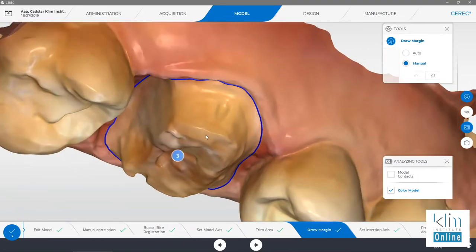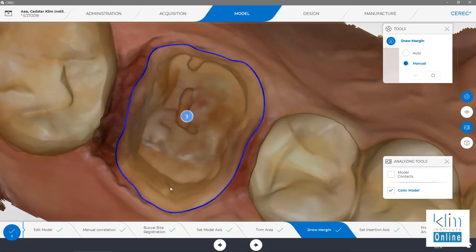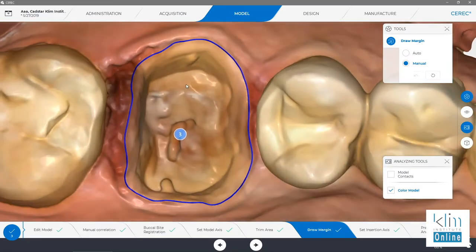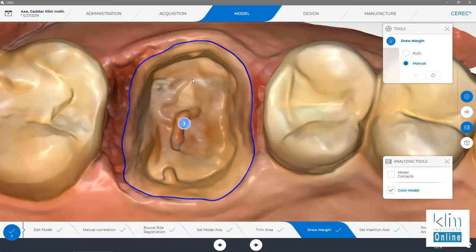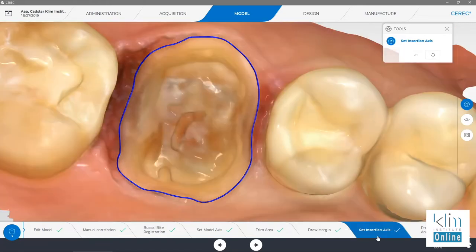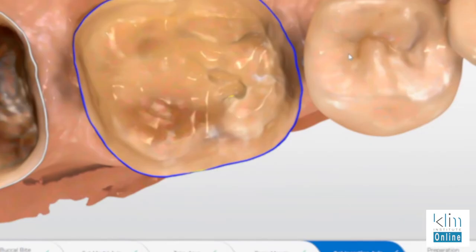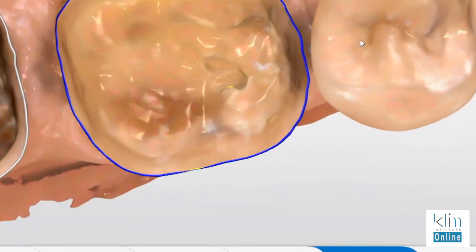We can see very detailed sub-gingival margins on the distal here — there was some decay extending way sub-gingival. As we observe, you can see there's quite a bit of burr curettage here on the distal and mesial. We manage that with hemostatic gel; no cord is packed. Check the insertion axis — this is actually the milling axis. We don't want to see any little yellow marks on that margin; otherwise the restoration won't go down or there'll be an open margin.